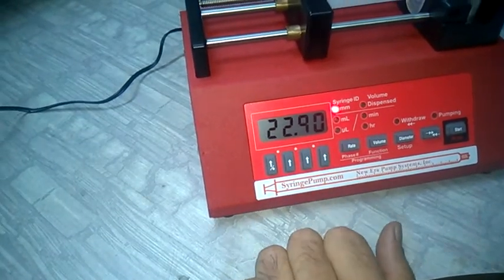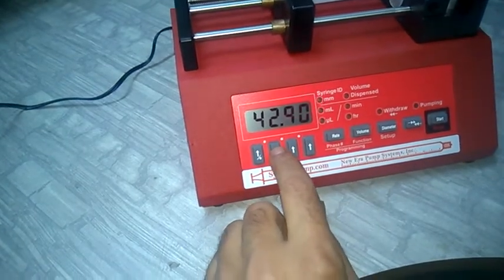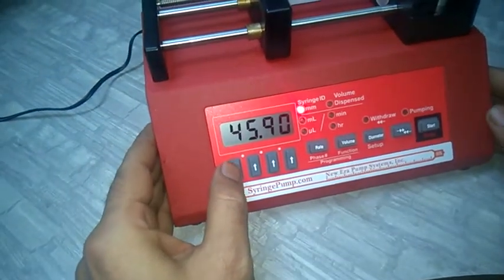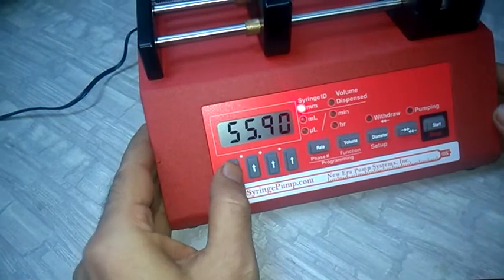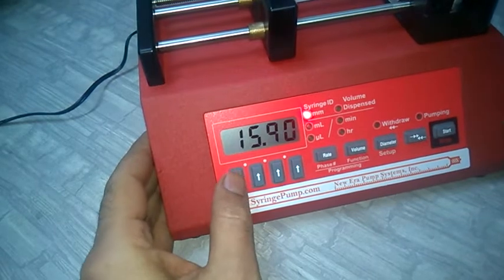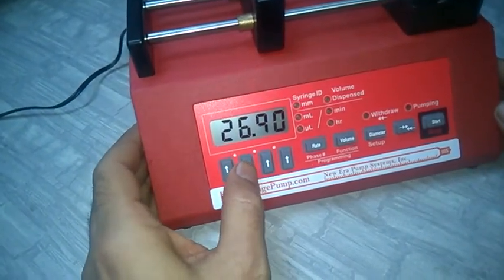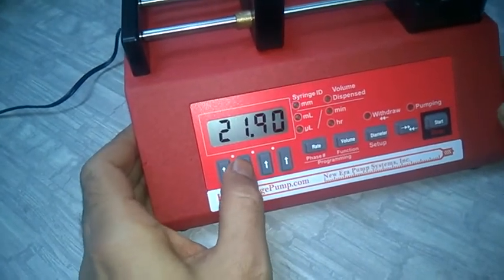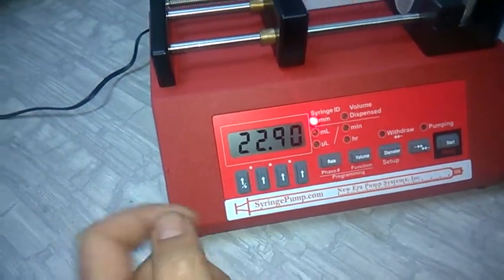Each arrow key corresponds to one digit on the LCD display. For example, if the first digit needs to be 2, keep pressing the corresponding arrow key and it will cycle through the digits: 5, 6, 7, 8, 9, 0, 1, 2. Similarly adjust the other digits until you have 22.9 mm as the diameter.